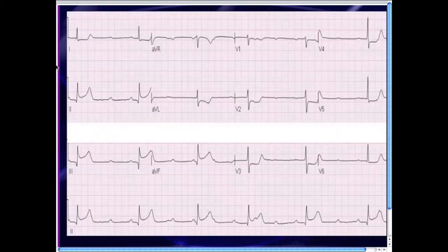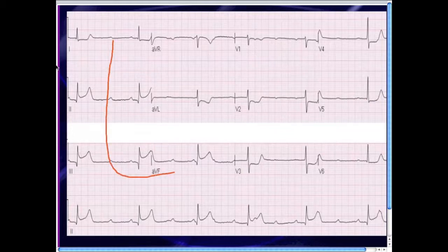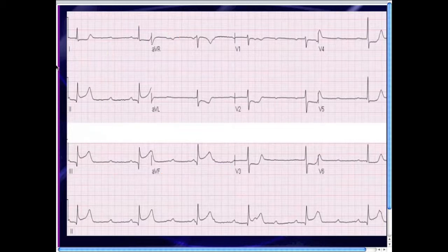Let's go to the second case he sent me. This is perhaps a little more straightforward. Once again, you look at the rhythm — the P waves are upright in 1, 2, 3, and F, and inverted in AVR, meaning this is sinus in origin. If you map out those P waves, they're going at a rate of about 100 beats per minute, so we'll call this sinus tachycardia.